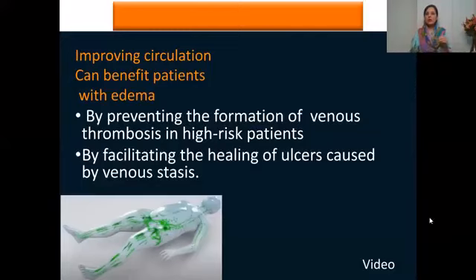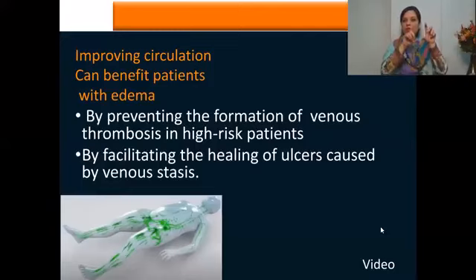We have applied the compression device that is basically going to include the sequences. You have seen there were different sequences. There are so many sequences that are going to exert pressure one by one. So they were inducing a wave-like feeling of the movement of the fluid.